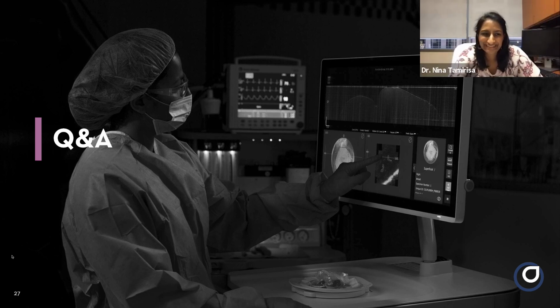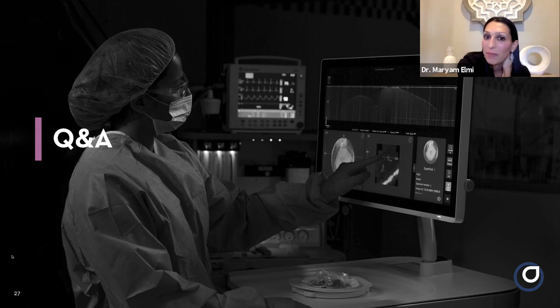I was just going to add one thing. Most of the time the surgeons will operate the OCT device and look at the margins, but the pathologists can also do that. And I know that some of the scrub techs are trained to do that as well. It just depends how you like to do things in your operating room, but it's pretty versatile, and you can get a lot of people on your team adept with the technology.